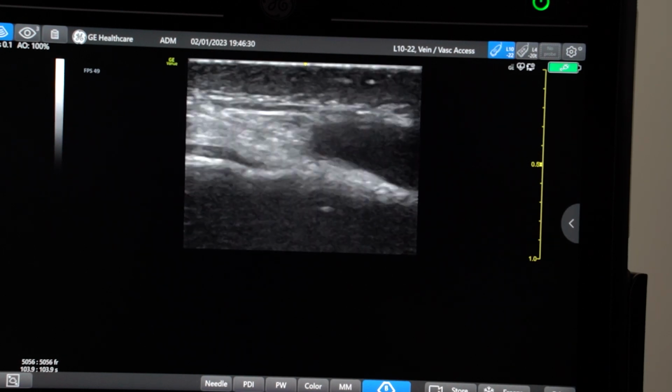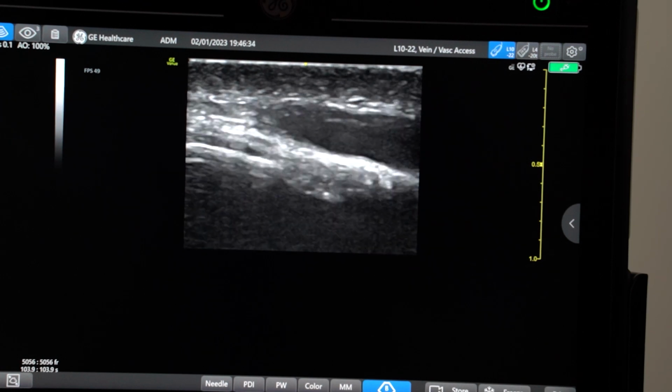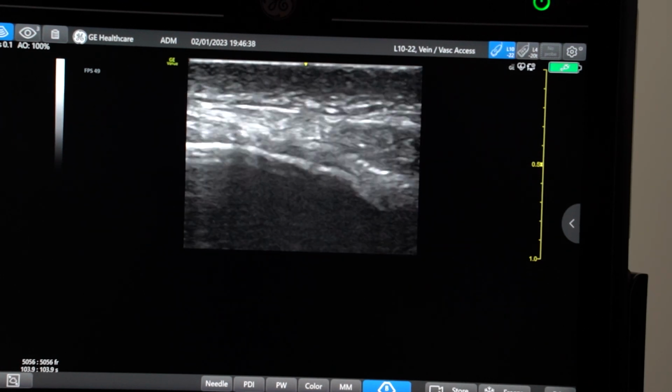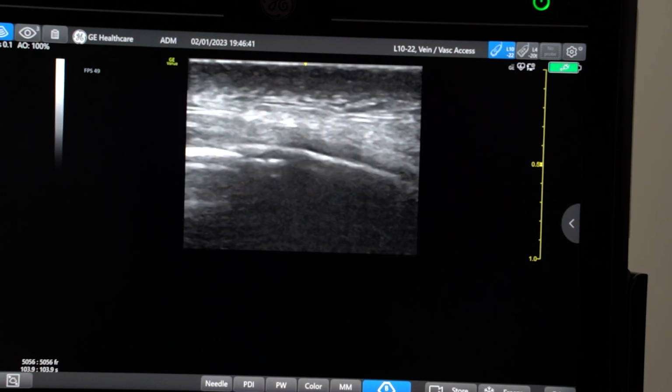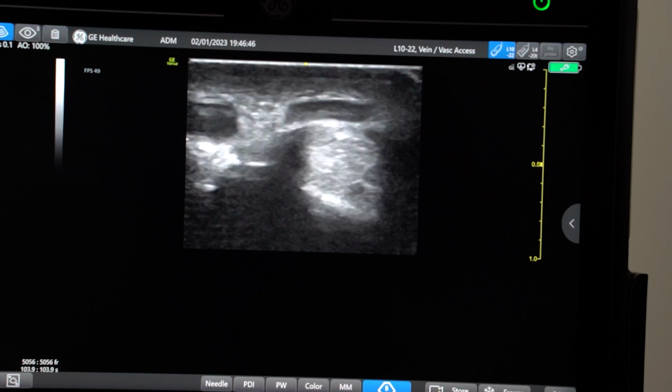And so you can have the patient move, and if their pain starts in a particular spot or a particular movement, you can help try and pinpoint that pathology and see where the catching, if that's what the problem is, is happening. So that's sort of the usefulness and precision that ultrasound can provide.